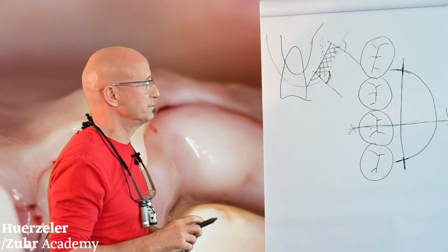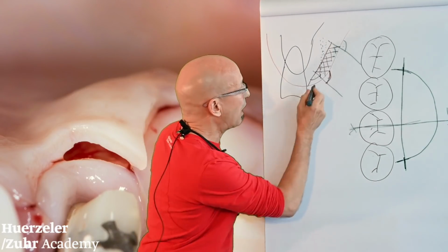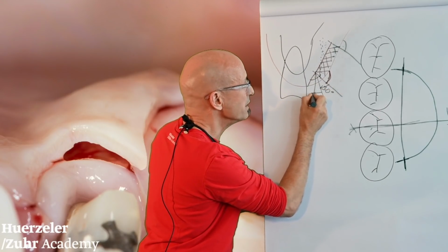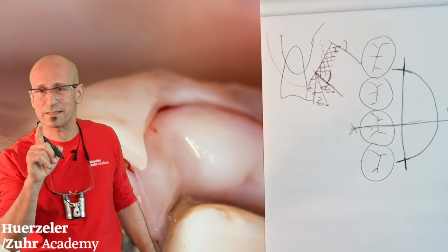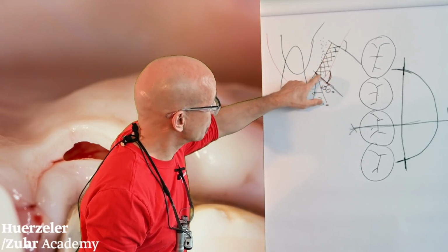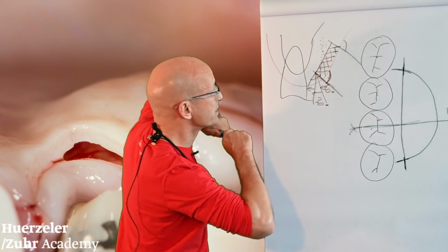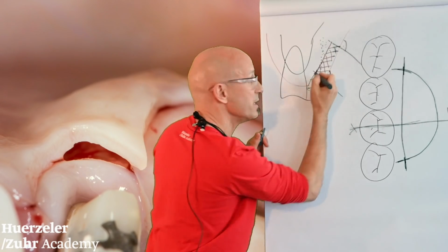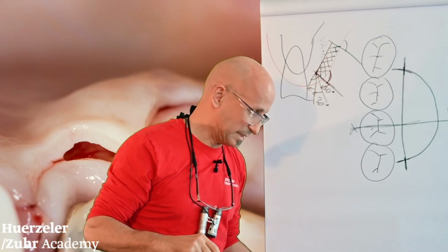So what we have to learn, and that's now really, really important, and we call this, how do we get around the corner here at this first incision. That's the secret. That's the maximum secret. How do we get around this corner, our first incision perpendicular to the surface? How do I get at this point here, where I afterwards can split down here in one layer? First, that's what you have to learn.